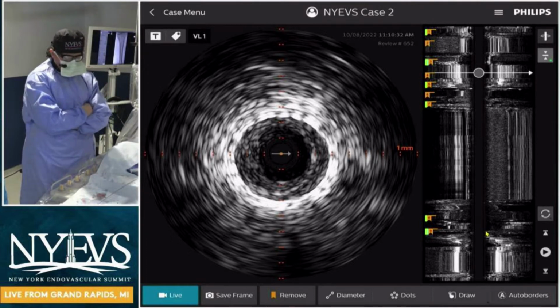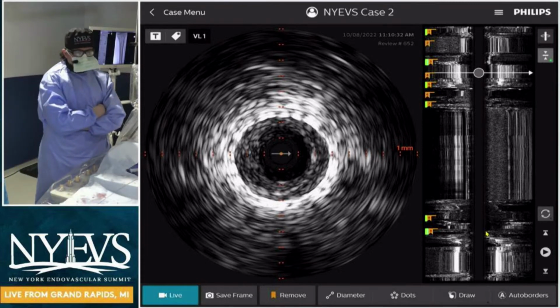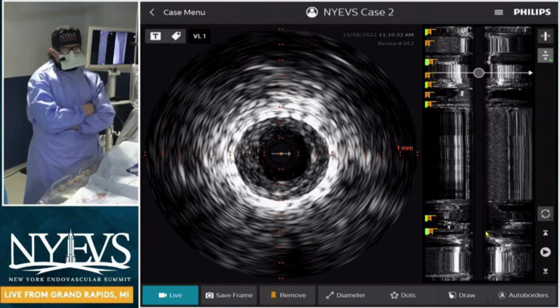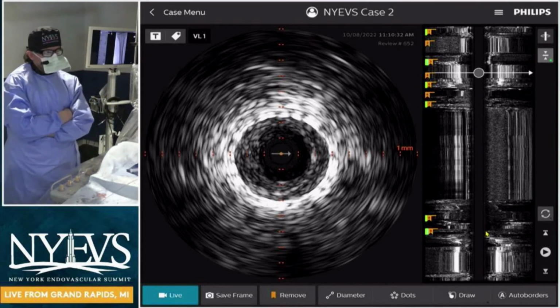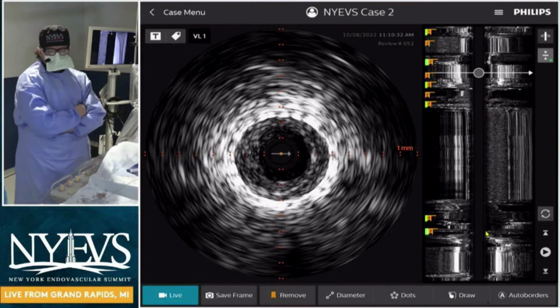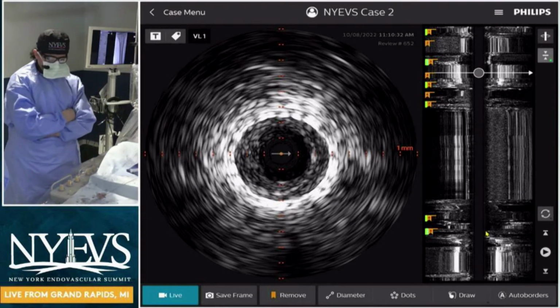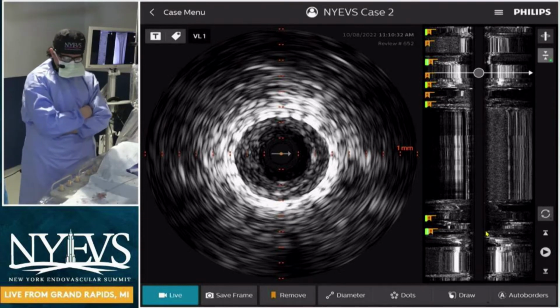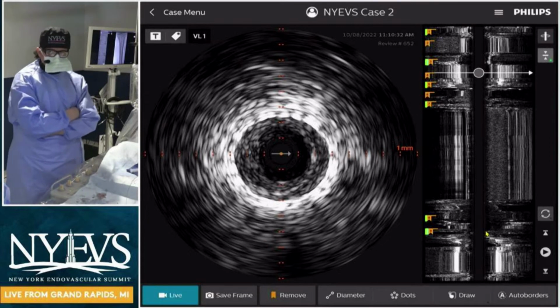At least, like you said, with Excite ISR, you have a randomized controlled trial showing efficacy of laser and IVUS in in-stent restenosis. And I think that's what I want to talk a little bit about, because we used to use a lot of IVUS. We've actually moved away from using IVUS because I don't find the value without having an outcome based on what I'm doing. Of course, when I don't know what I'm seeing, we use it. So what are your opinions? I know you, Brian, and you, Fadi, use a lot of IVUS. How do you feel about that?